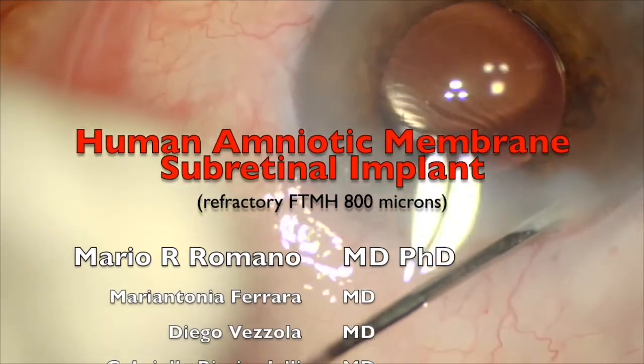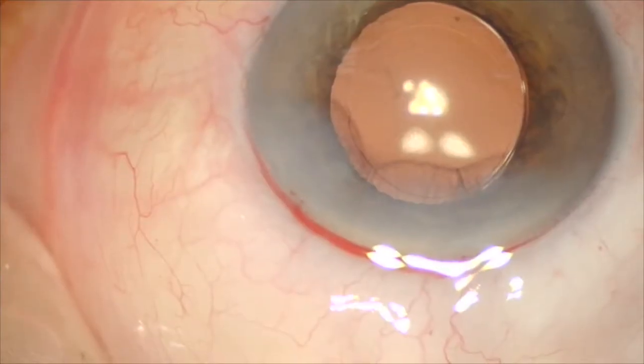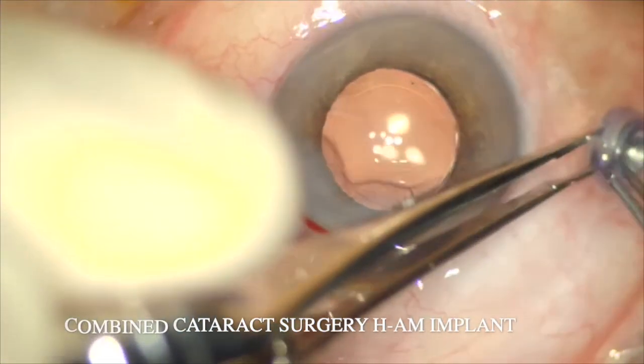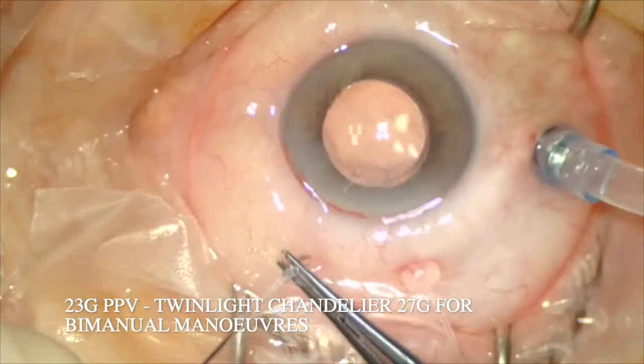Good morning, good morning everybody from Humanitas Castelli. Today I will show you the subretinal implant of a human amniotic membrane for a refractory full-thickness macular hole of 800 microns.